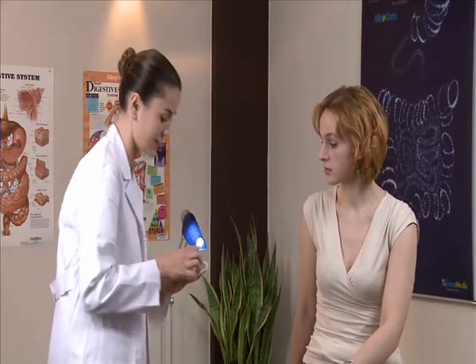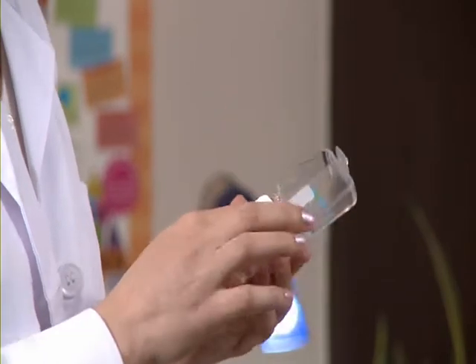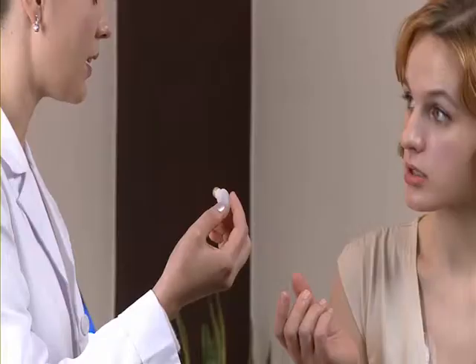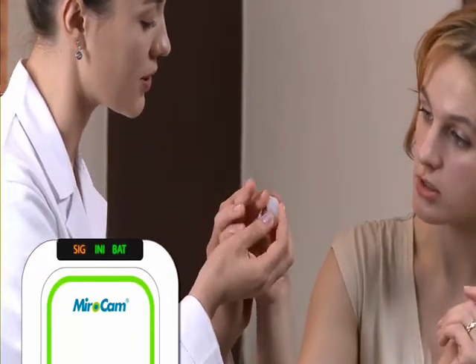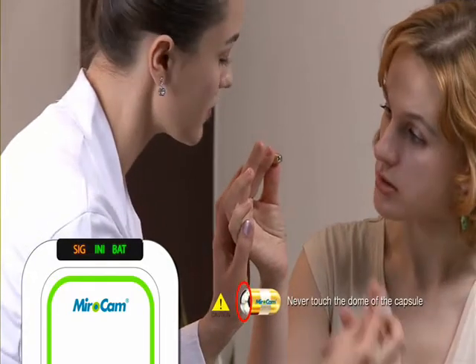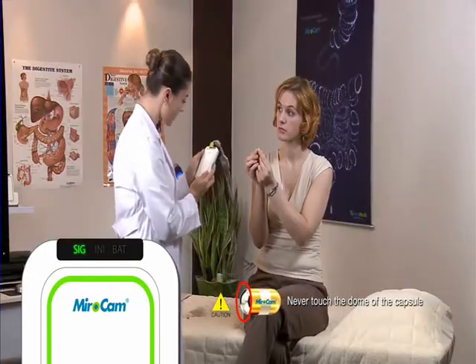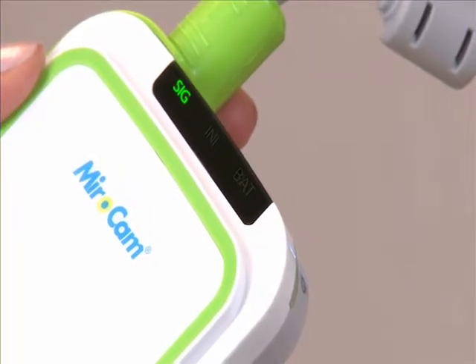Open the capsule packaging and take the capsule out of the case by the opaque plastic capsule holder. Check to see if the capsule light is flashing. Instruct the patient to hold the capsule by the gold bands between the forefinger and thumb of both hands. After the patient grasps the capsule, check if the signal indicator on the receiver is green. Ensure the indicator is green prior to ingesting the capsule. Ingest the capsule with water.